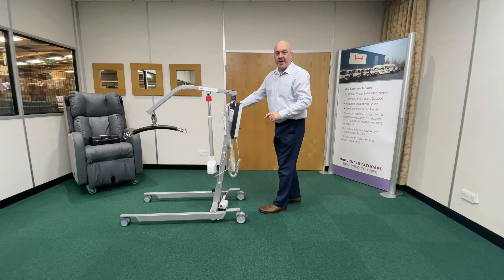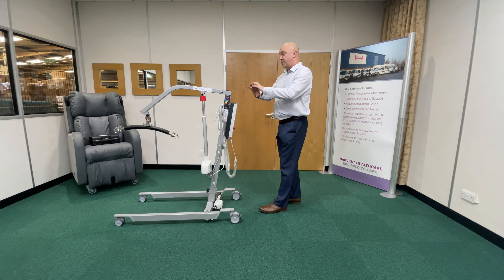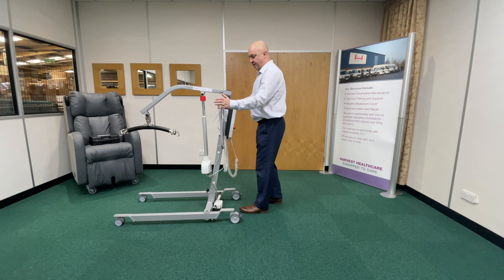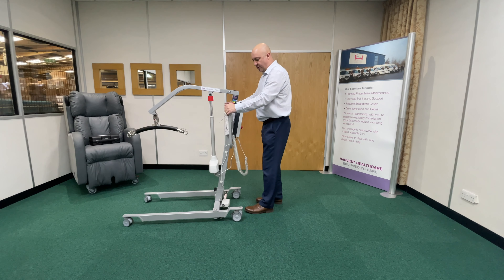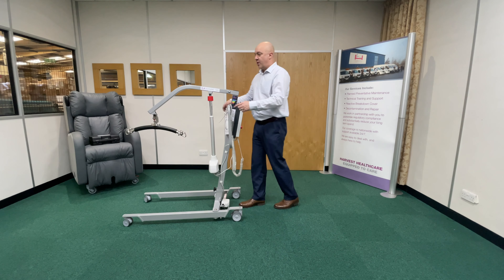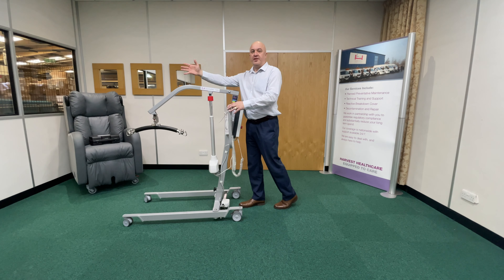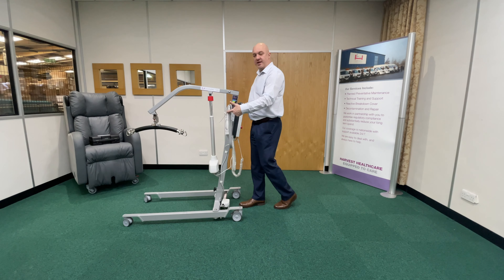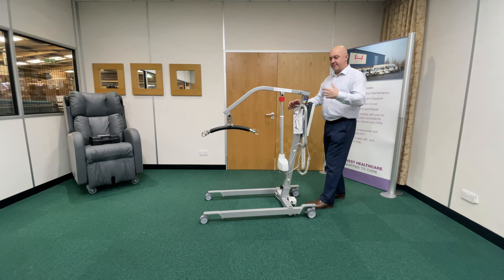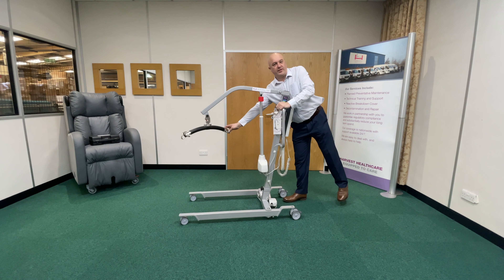So put the hoist under the bed — you can by all means attach the sling to the hoist to get everything ready — but before you press the up function, take the back of the hoist and make a quick circle to change the direction of the casters so they're now facing forward. So when I want to lift the person in bed and move them back, I can literally use my fingers because the hoist is already prepared to move in that direction, and I'm not going through that stop-start phase causing swinging or banging of legs against the hoist.